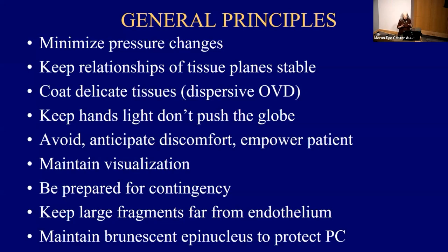Keeping your hands light and not pushing the globe for resonance. If you're always seeing that you're constantly having to move your microscope XY, you're never in the center in your video, that means that you're influencing the tissue. And if you're doing that, the tissue can't influence and talk to you. So you want to be a little bit lighter with your hands.